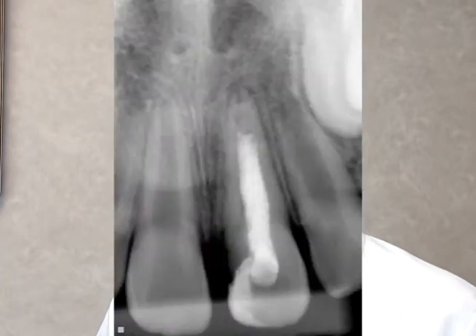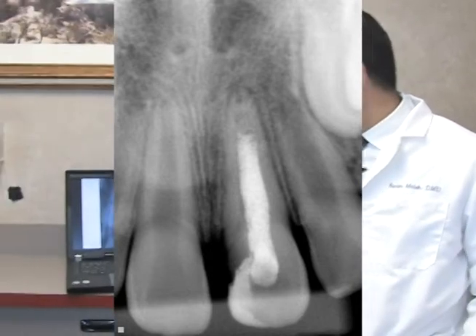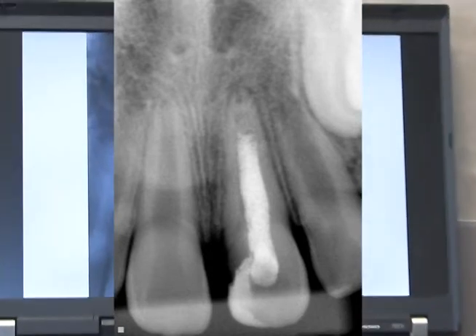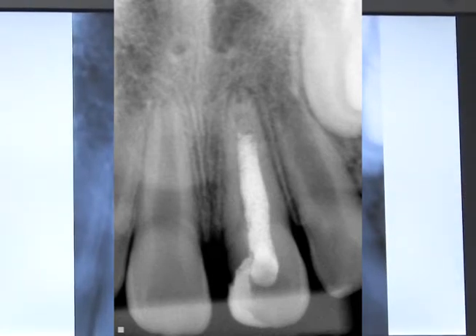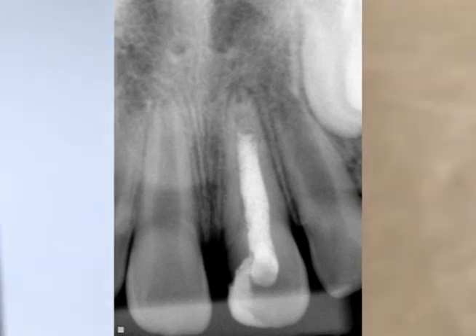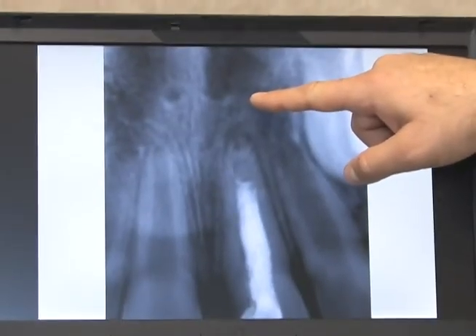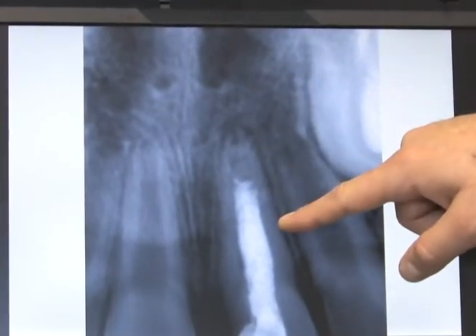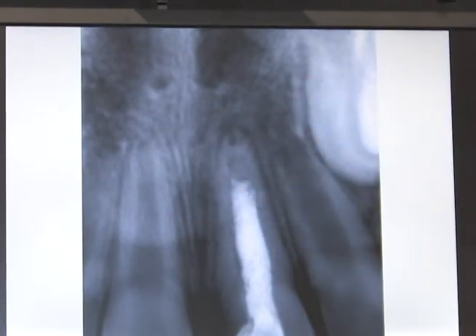treated. So they opened the tooth. It was actually a pedodontist. So he opened the tooth and placed calcium hydroxide inside the canal, and as you can see, within a year, from where I saw him on the last picture to this X-ray, the apexes are closing up. And you can tell that the apex of tooth number 9 looks closed up, and pretty closed up on tooth number 8.